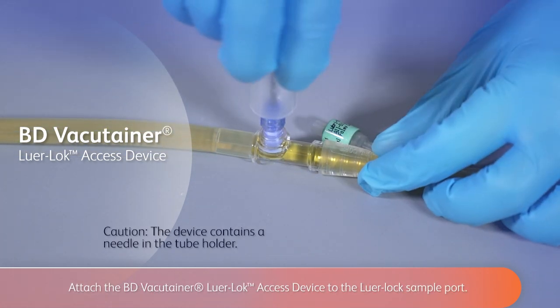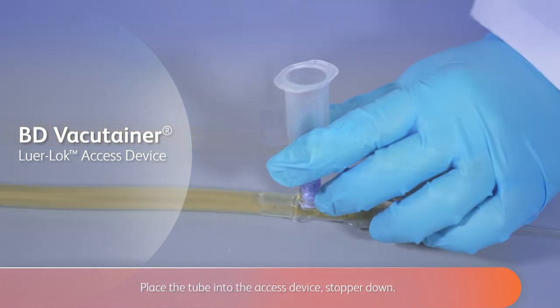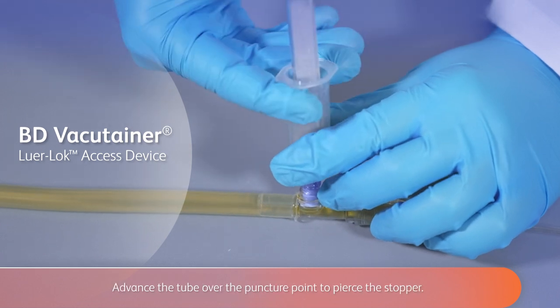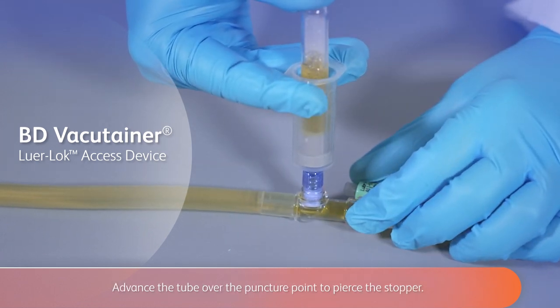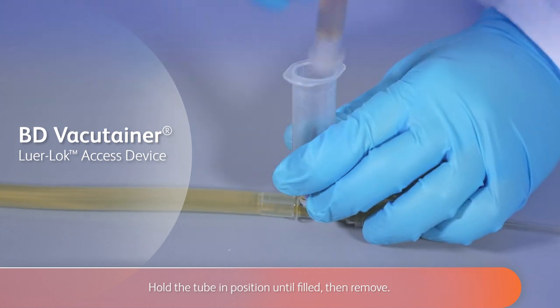Attach the BD Vacutainer Lure-Lock access device to the Lure-Lock sample port. Place the tube into the access device, stopper down. Advance the tube over the puncture point to pierce the stopper. Hold the tube in position until filled, then remove.